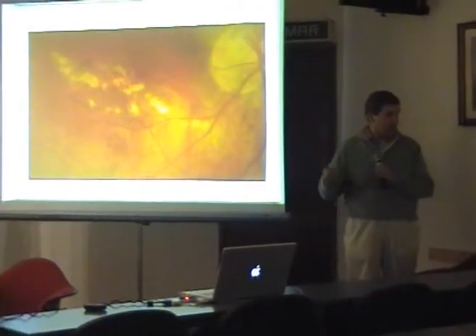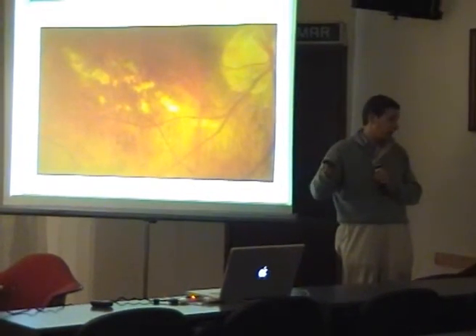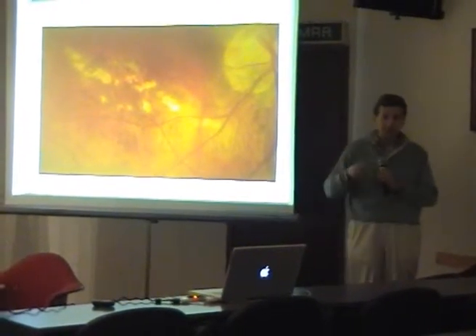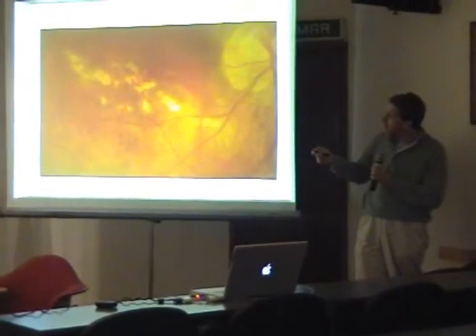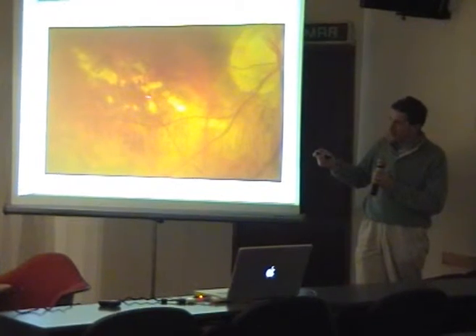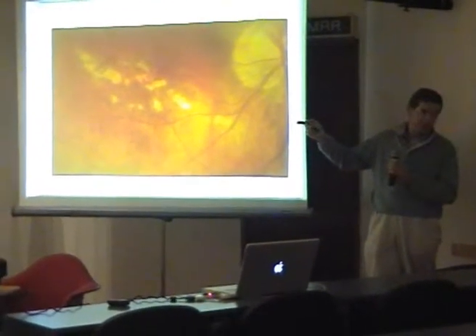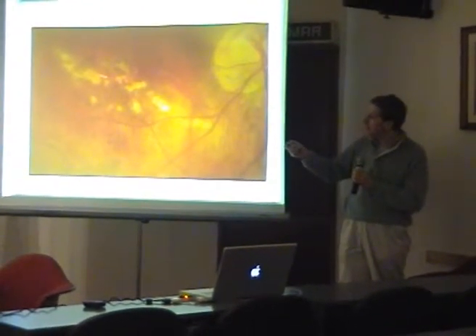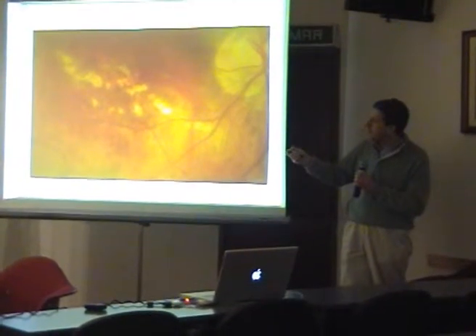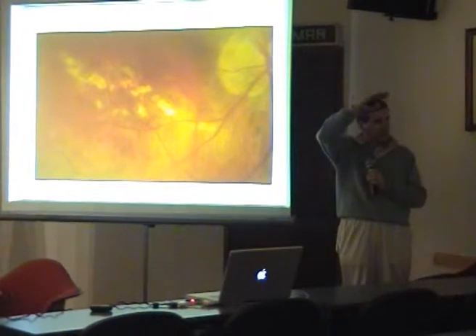And she did very well. She moved from 0.1 to 0.8 in less than 1 month. So it was particularly good for her. However, we treated on December 27, and on February 13 she came back complaining of some scotomatous area in the upper area.